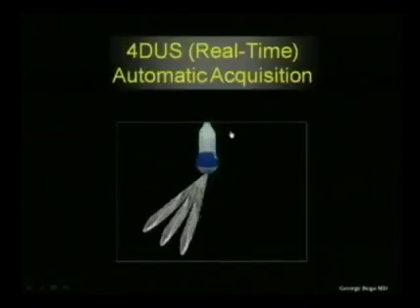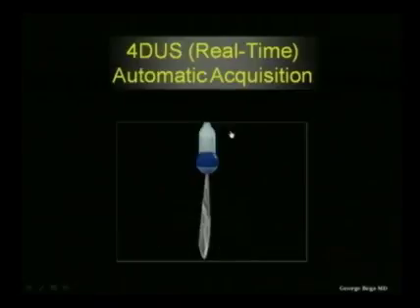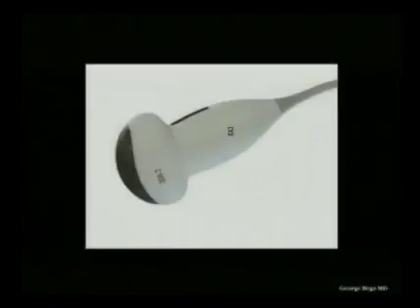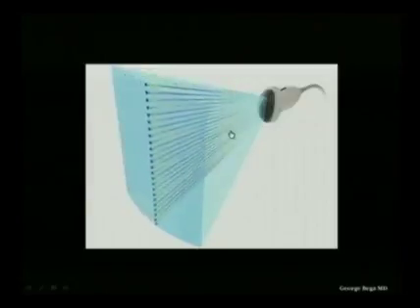Here's how a 3D acquisition at the level of the 4-chamber view would work. This is how you would acquire a volume at that level. And here is a 4D acquisition, where the transducer keeps acquiring 4D slices. 4D acquisitions are important because they will enable the operator to acquire a number of volumes in continuity, and on the fly these volumes are displayed on a monitor. Here in this animation, you see that the transducer is moving over the area of interest, and it keeps acquiring several volumes in succession at an operator selected speed and angle.